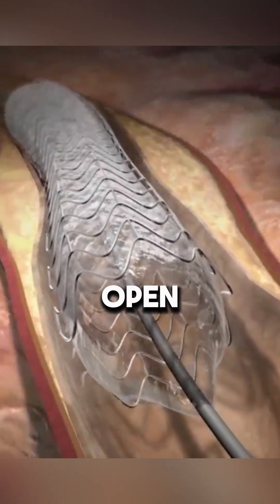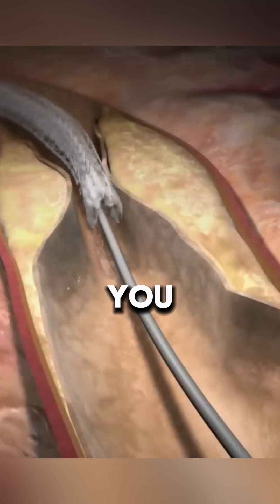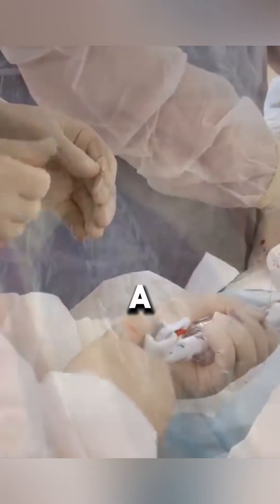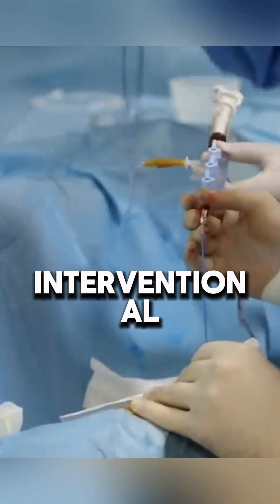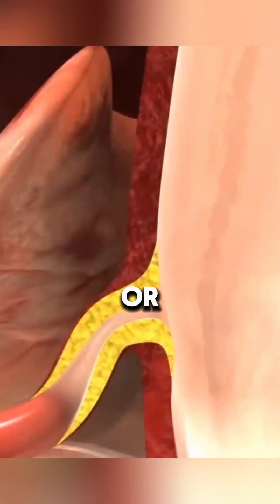Have you ever wondered how doctors open blocked arteries without surgery? An angioplasty is a procedure that clears blocked blood vessels without the need for surgery. During the procedure, an interventional cardiologist inserts a sheath into an artery in your groin or wrist.